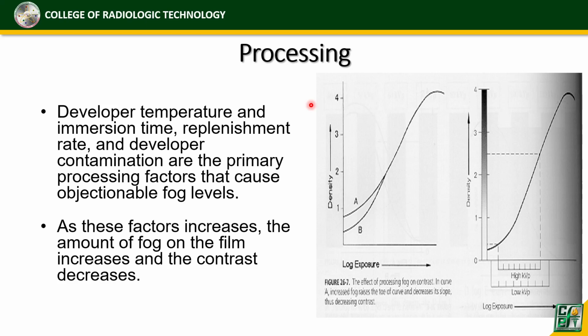So, what will happen is, there will be no image in the film. Siyempre, kung wala kang image sa film, wala kang contrast, di ba? Bakit, sir, bakit po walang image sa film?